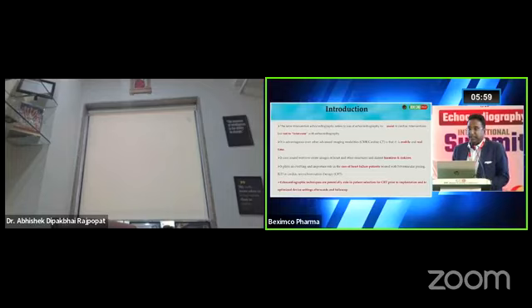Echocardiography to assist. Without echocardiography, we will not intervene, because all day long we learn things from the legend cardiologists and echocardiographers. So I will not repeat these things, but one advantage is that it is mobile and real time, and also it is a very important tool for heart care management.